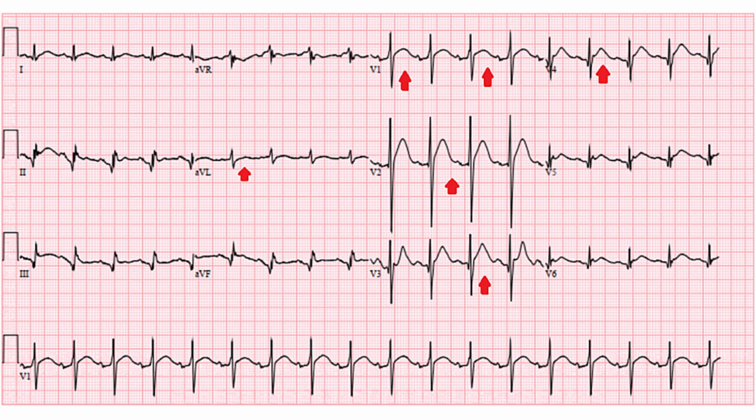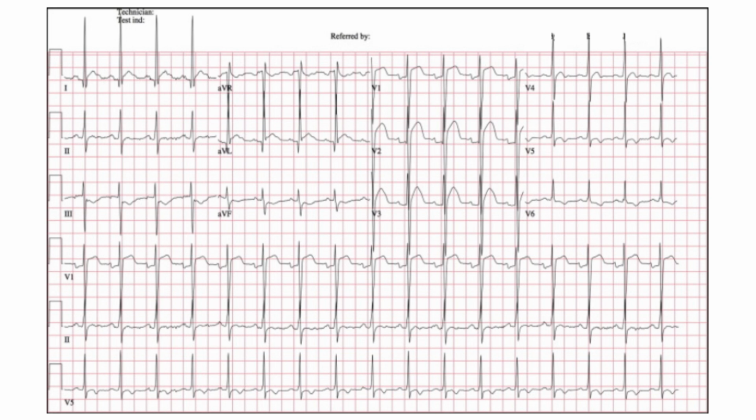So here's an EKG from someone who presented with hypercalcemia and ST elevation. You can kind of see the dome-shaped ST elevation, especially in V1, V2, and V3. This EKG might even be a better example of ST elevation in hypercalcemia.